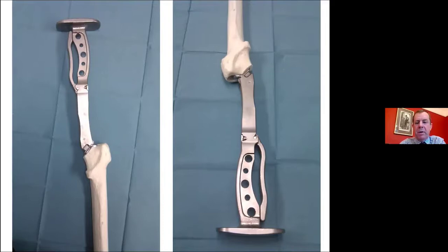With a young patient with very hard bone, it's much more of a gradual stop, and the prosthesis will rarely fill the whole cavity in the proximal femur. The implant is designed to be calcar conforming, so it should be in contact with the calcar on the medial side. How far it goes laterally depends on bone quality.